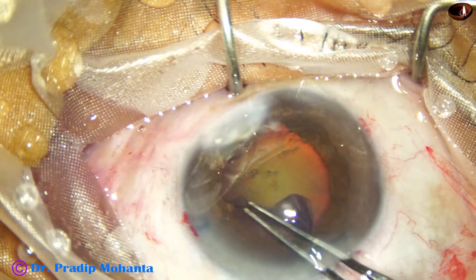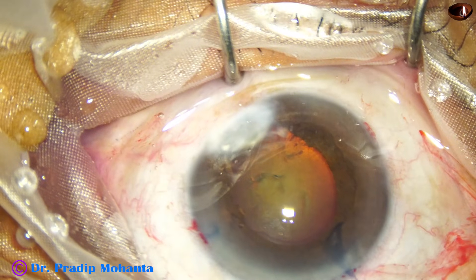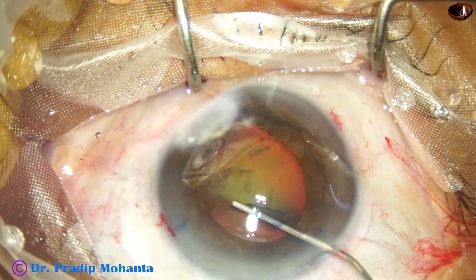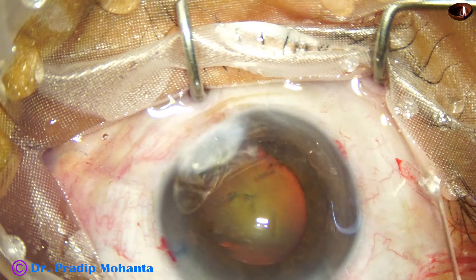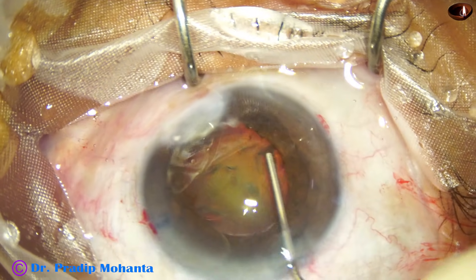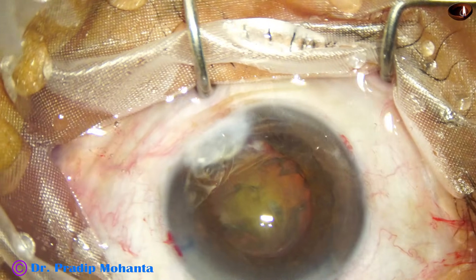With utrata forceps. The size of the rhexis is adequate, about 5.25 millimeters. Hydrodissection is done. The nucleus is quite hard, about grade 4 nuclear sclerosis.